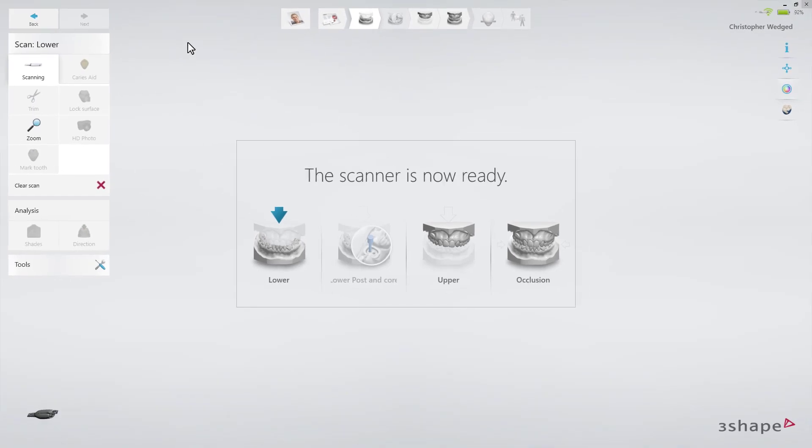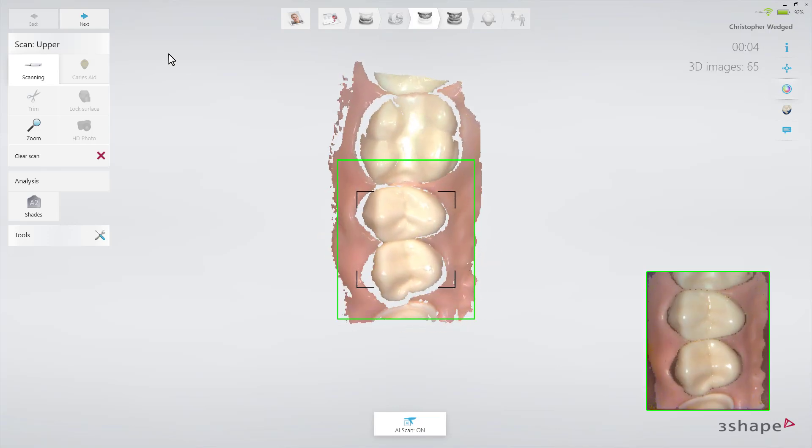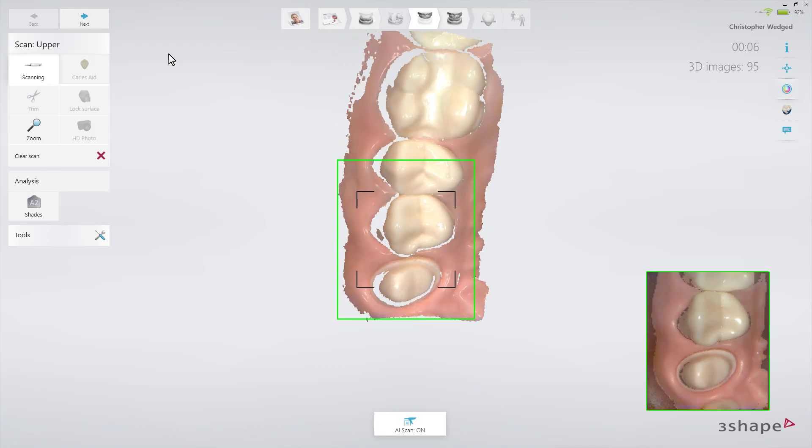First, use retraction cord and/or a hemostatic agent if parts of the margin line are subgingival. In this case, start by scanning the opposing arch to allow time for the retraction methods to take effect. As the preparation is on the lower arch in this particular case, start by scanning the upper arch.